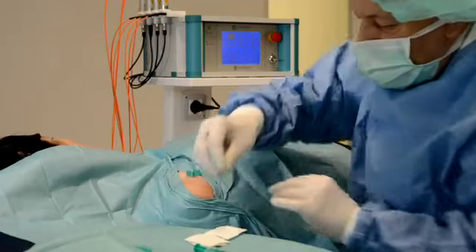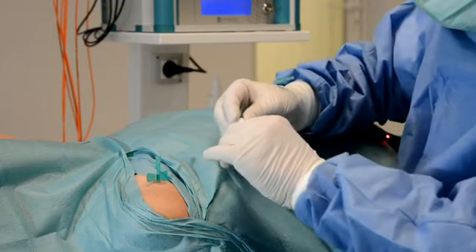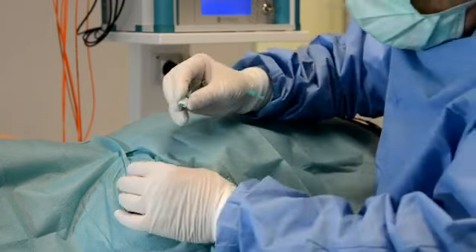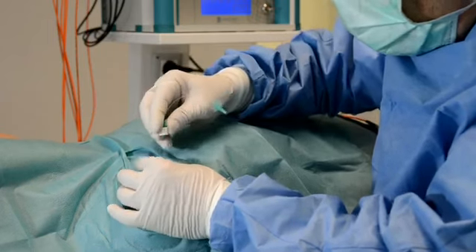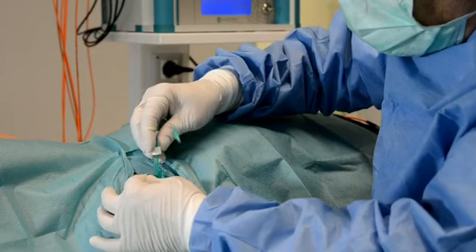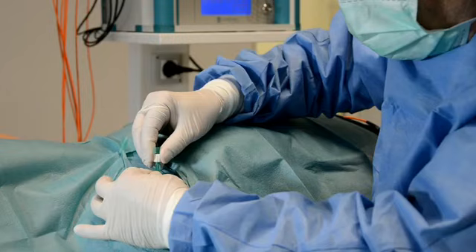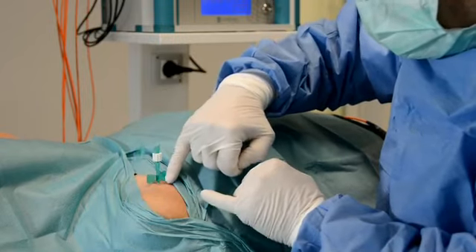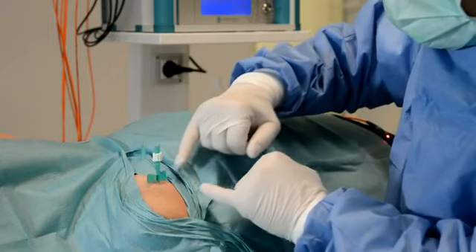I remove the cap at the end and will now insert the sterile end of the laser catheter into the butterfly and fix the needle by screwing at the end. So the end of the catheter is now directly at the end of the needle and is irradiating exactly the pain area.